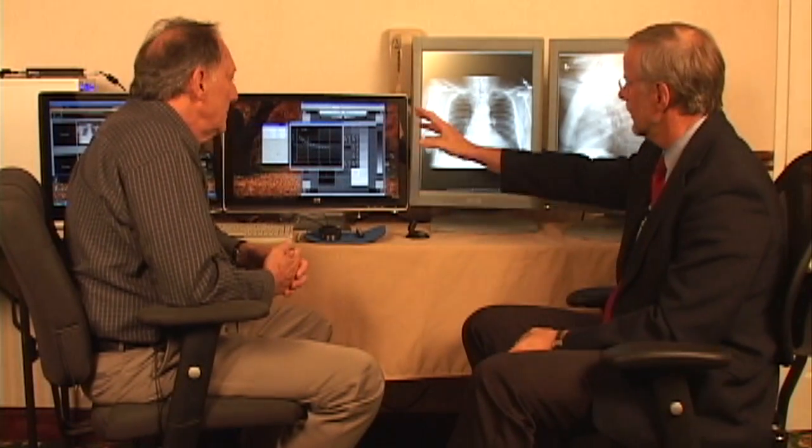There's actually not a lot of work. You look at the QC test pattern, and then if needed, in 1 or 2 minutes, you do the calibration. It's definitely feasible and not too much of a burden potentially. No, it's not. A doctor could do this at his home office with very little instruction.